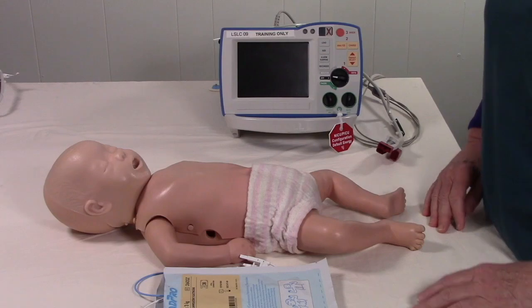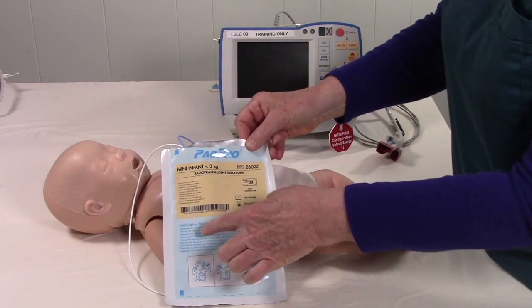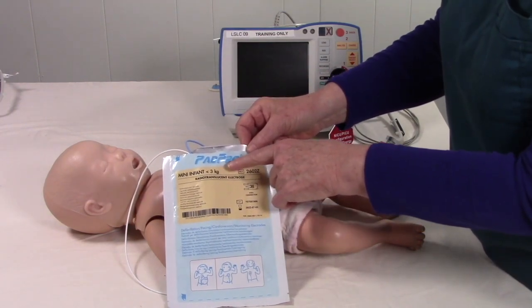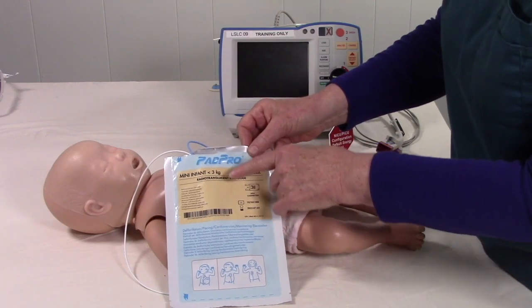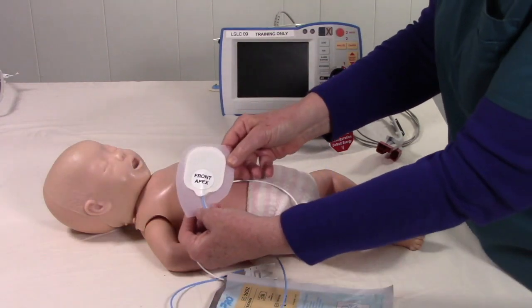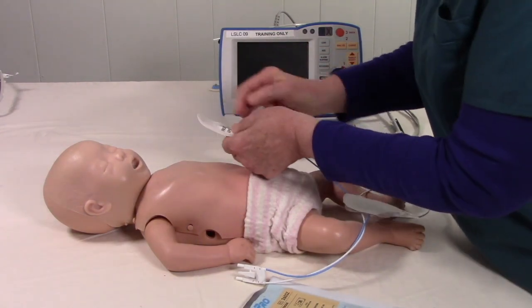Now we're going to go over the placement of the Pad Pro Mini Infant pads. You can use these for defibrillation, pacing, or cardioversion — but remember, only for infants who weigh less than 3 kilos. Once you open the packet and take the pads out, they will tell you exactly where to place them. Remove one at a time so they don't stick together.